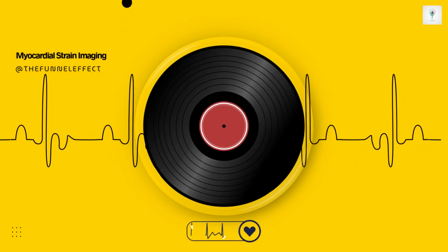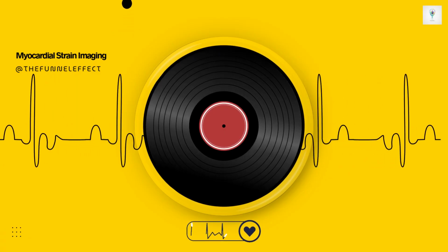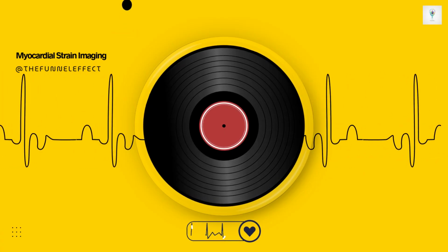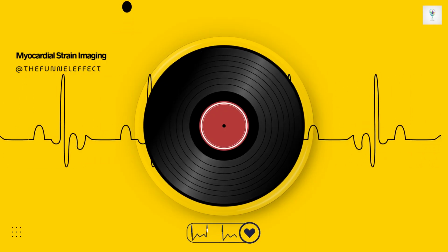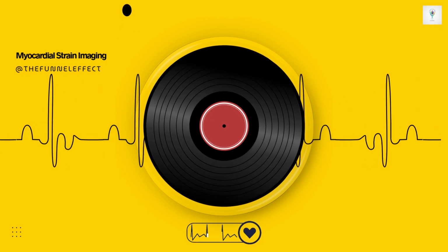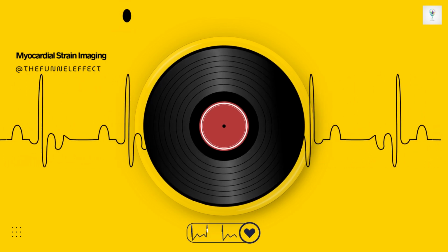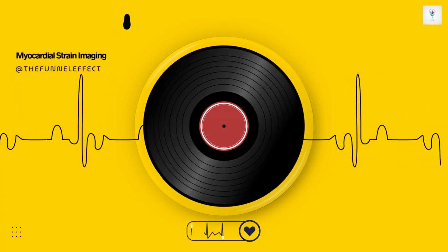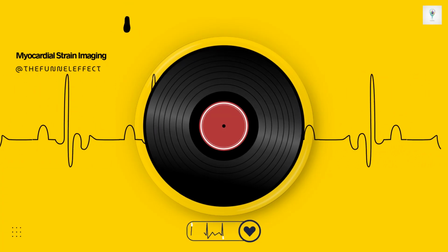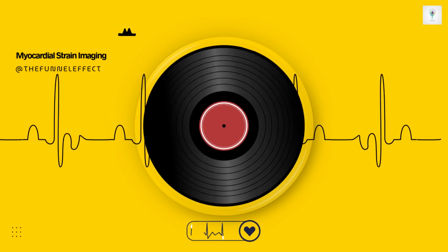So it's not an absolute value, but a percentage drop from their own starting point. Exactly. So if a patient starts with a GLS of negative 20%, a drop to negative 17% would represent a 15% relative decline, 20 to 17. And this matters even if their EF is still technically normal. Yes, crucially. This 15% relative GLS drop, even if the LVEF remains above 50%, is used to define mild asymptomatic cancer therapy-related cardiovascular dysfunction, or CTRCD.